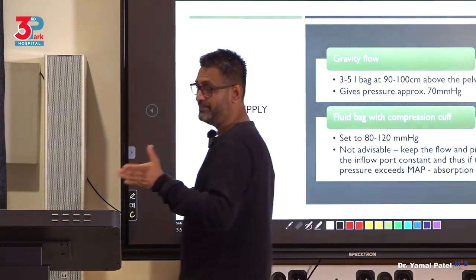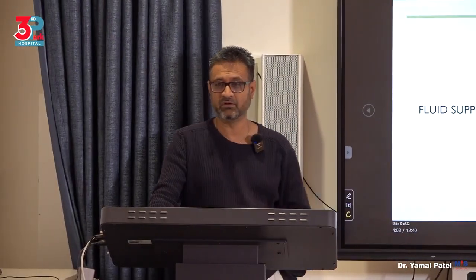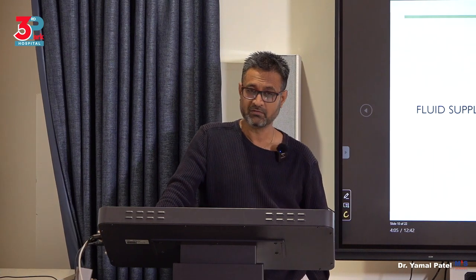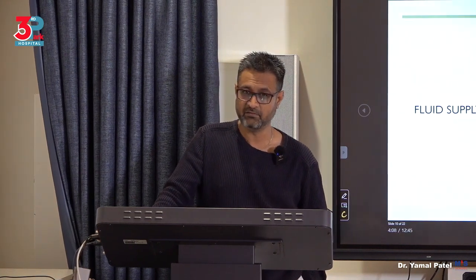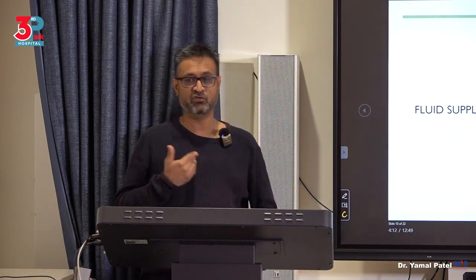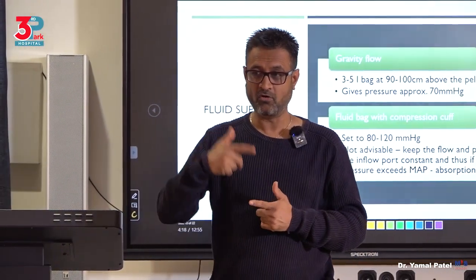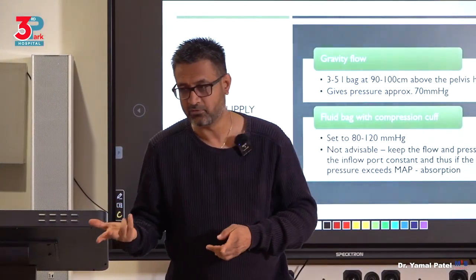So the problem with this mechanism is it will not give you the constant pressure, variable flow model. So again, it is not very good for the type of work we are doing if it is going to be operative and prolonged, okay?